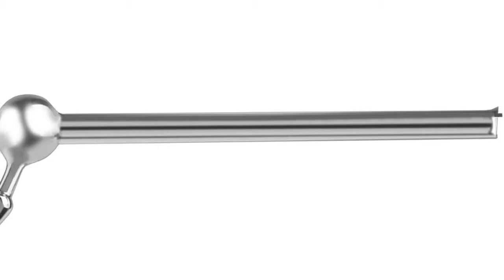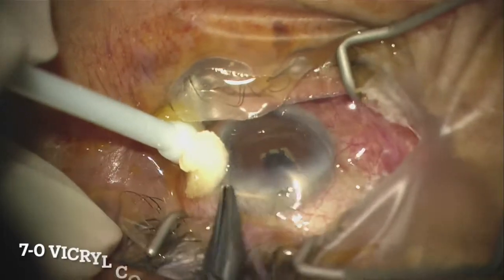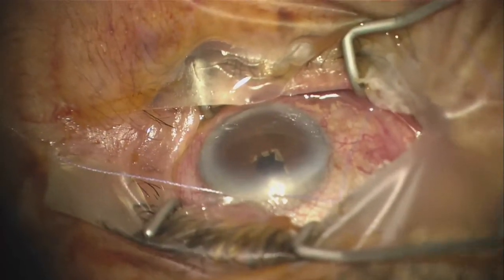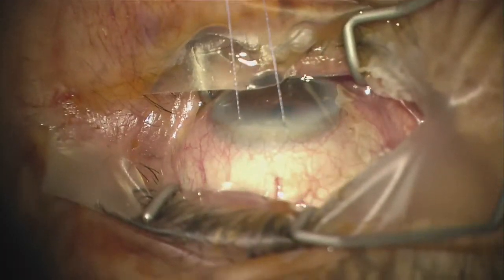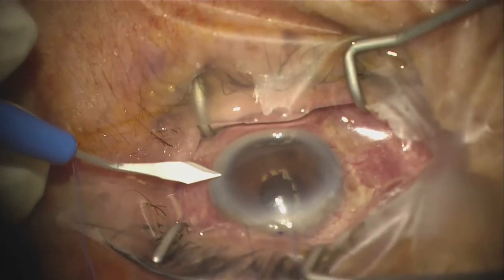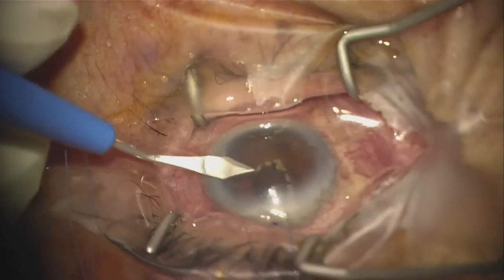Or, if you do have a small eye, instead of using the Vera hook, consider using a 7-0 vicryl superior corneal stay suture to infraduct the eye well to expose superior conjunctiva. For high cheekbones, make the temporal corneal incision more superior than inferior in order to have easy entry with your inserter.